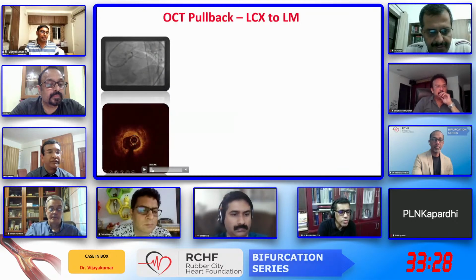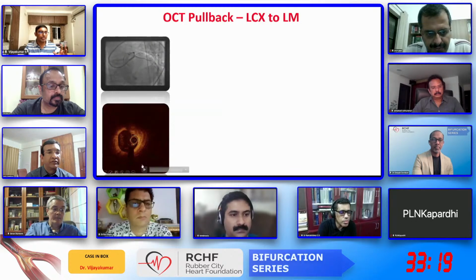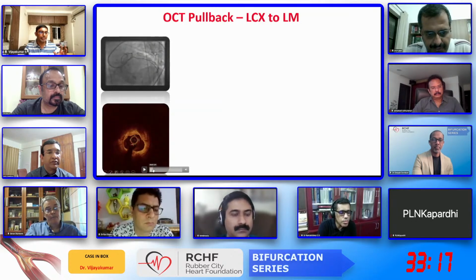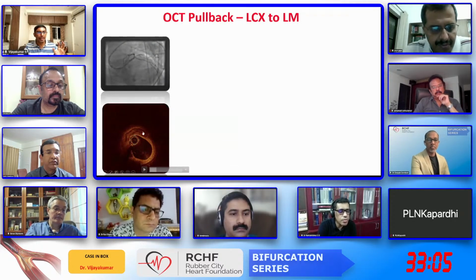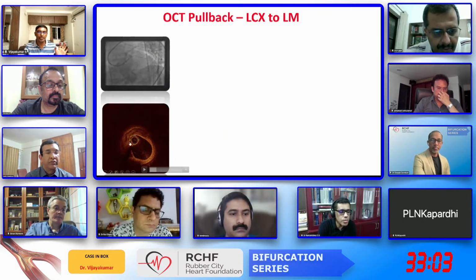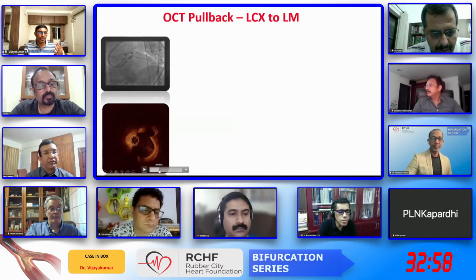It's not very thick, and everywhere we had calcium. In some places it is very thick, but in all the frames there is an area which is less than 0.5 millimeters. Again, there's a lot of calcium, 270 degrees here almost. And here there's a small side branch, and again it's not very thick. You can see it is about 0.5 millimeter here. And this is thick, but hopefully this area should give way. Now we have to decide whether to do an atherectomy or not. But it is reasonably okay.